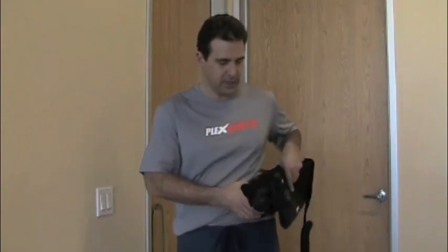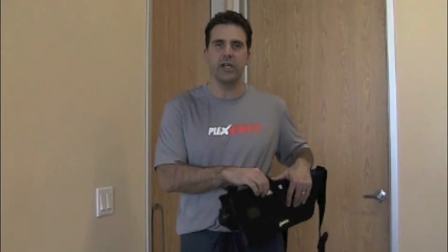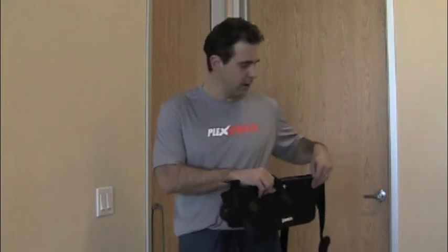So I'll go ahead and start by showing you the sling. How to put it on, put it off, and then we'll go from there. This here is a standard abduction pillow that fits to the side, in addition to a sling. I like these slings primarily because they breathe a little bit better than some other slings that are out there.